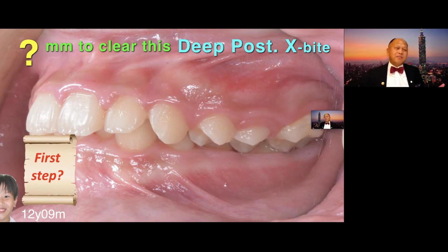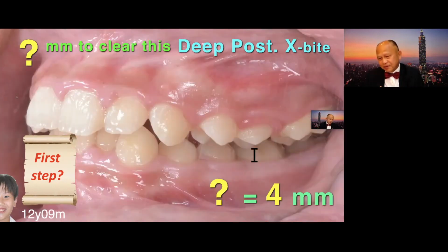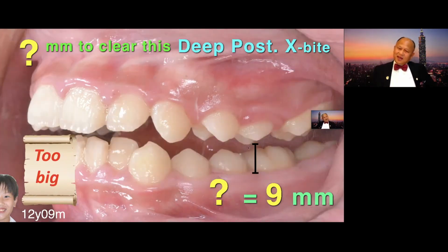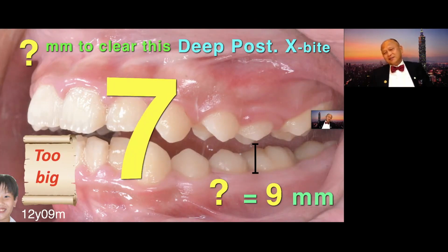The first step happened to be to decide how many millimeters to clear this deep posterior crossbite. So we opened up 4 millimeters. Not enough, because you didn't clear this crossbite. Open a little bigger, 6, barely. And 9 millimeters, it's too much, too big.